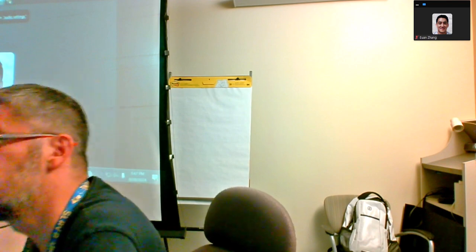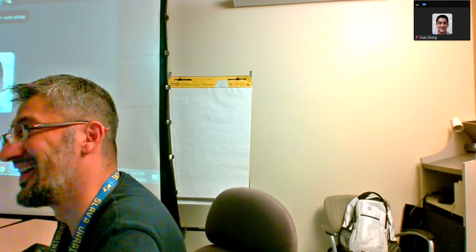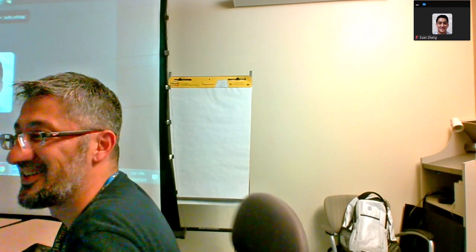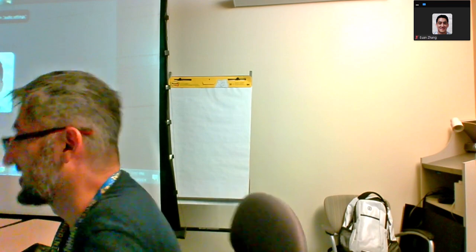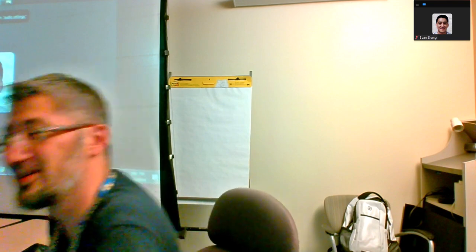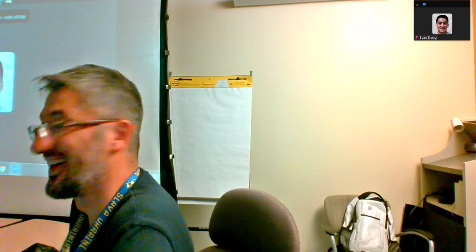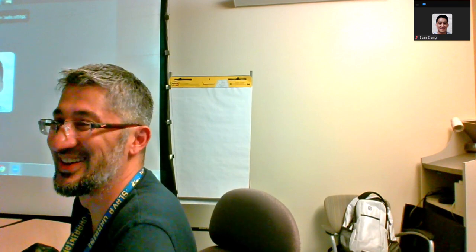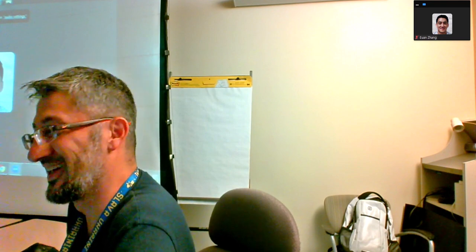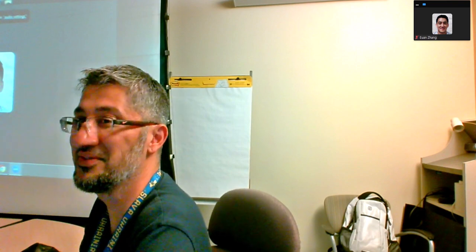Are they normal or abnormal? At least one. You can check your slides, notes. You have 20 seconds. Okay, starting now. Ready?